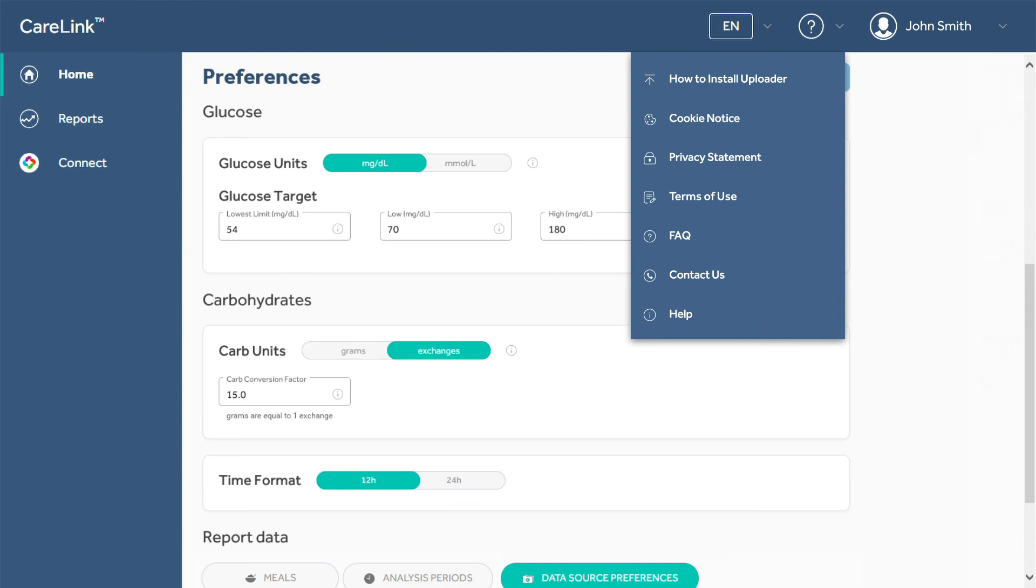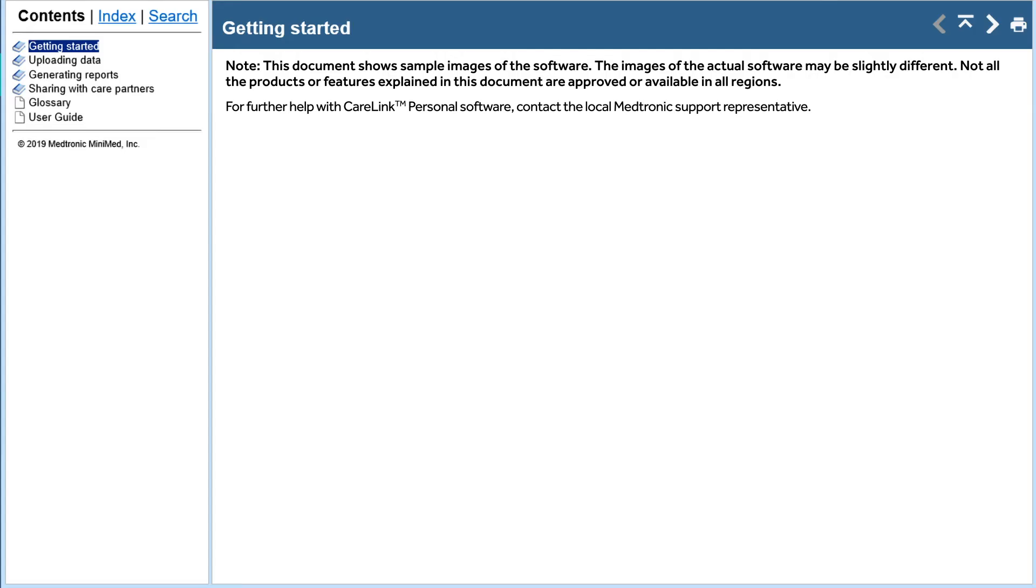The notices and privacy statements and the FAQ link to PDF documents. The Help menu takes you to an interactive user guide that allows you to select instructions for common tasks or search for your topic. You can also print any of the sections by clicking on the printer icon in the top right of the window.